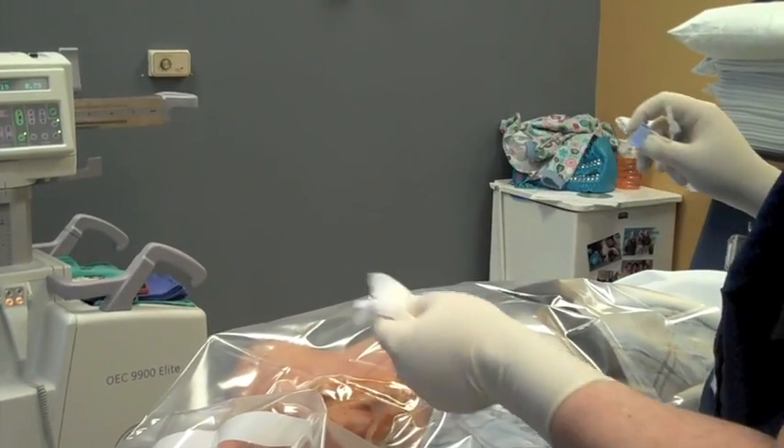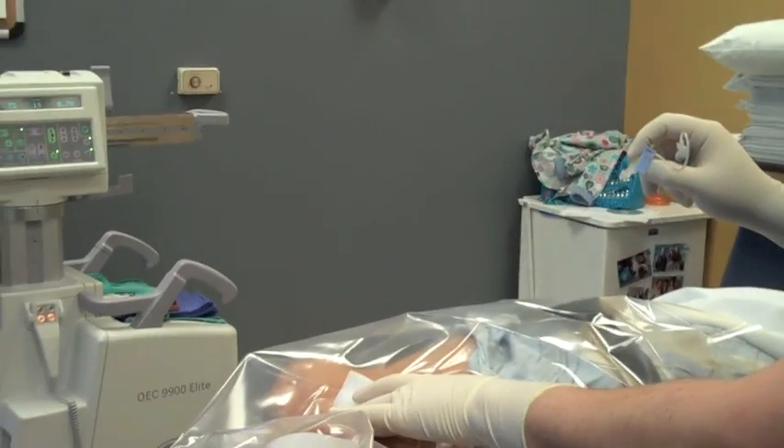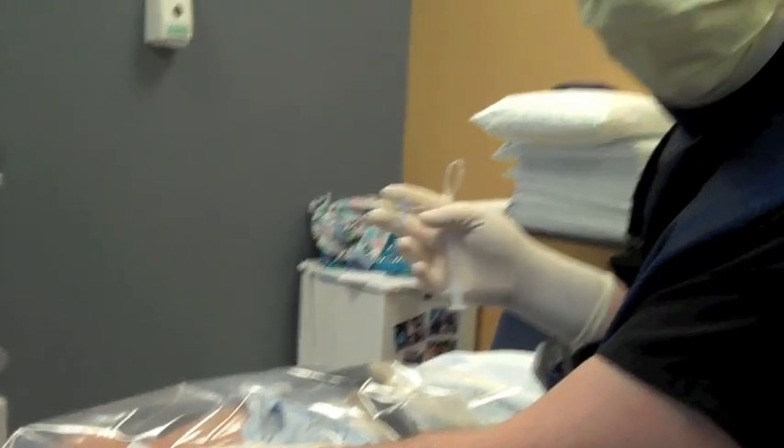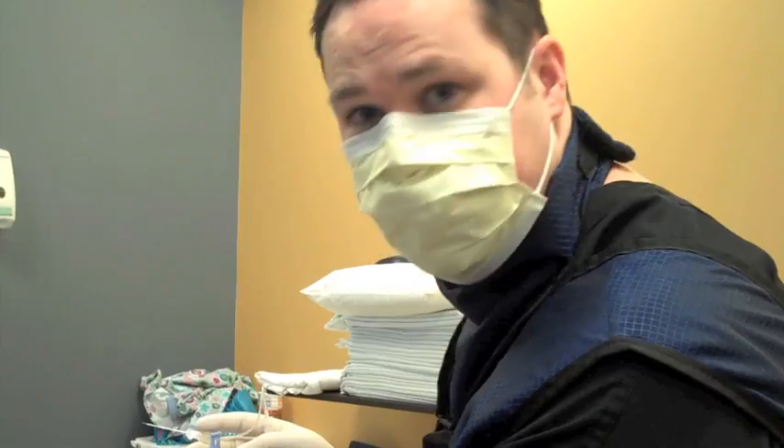I'm going to go ahead and take the needle completely out now, and I'm going to place a little bit of gauze right over that area. Hold just a little bit of pressure, and we're all done with the stellate ganglion block. You did great, sir. I hope this really helps you out. Thank you, everyone.